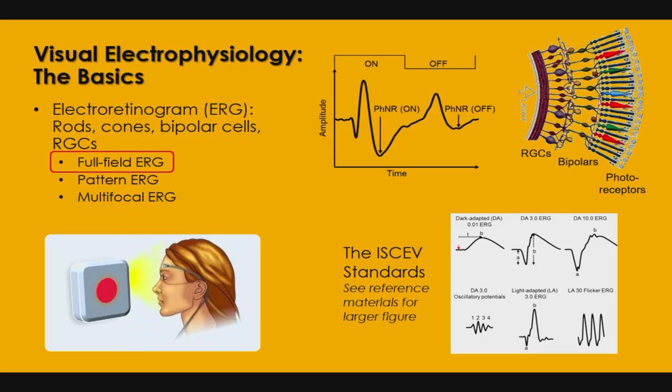And then they can also make the light flash very quickly and see how quickly your eyes respond. Think of strobe lights, you know, the disco lights, how well your eyes respond to things like that, and then they measure it.